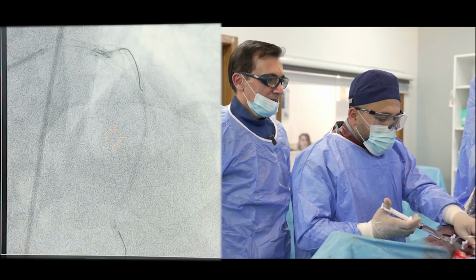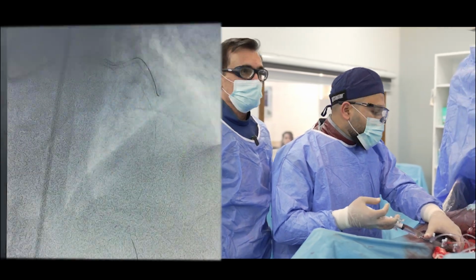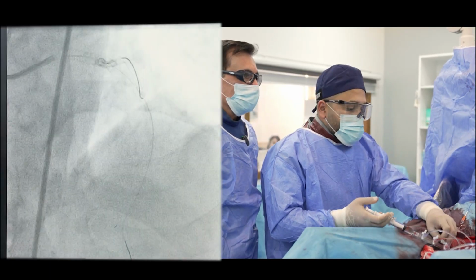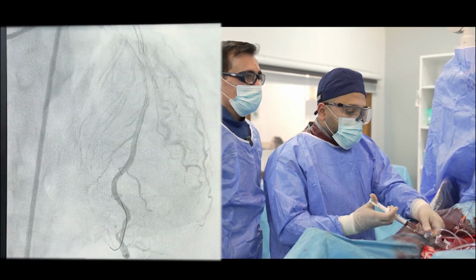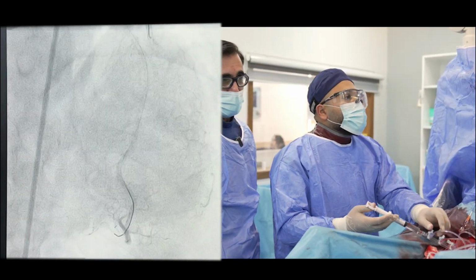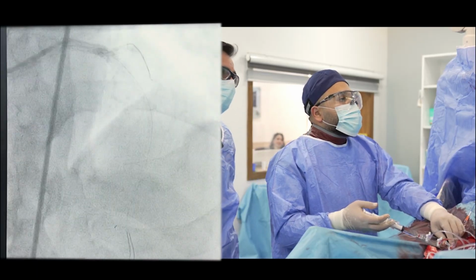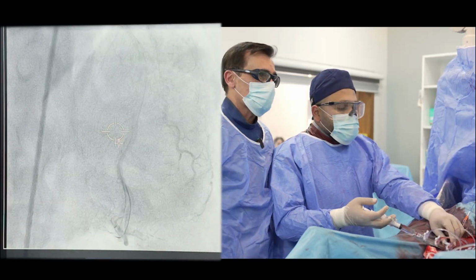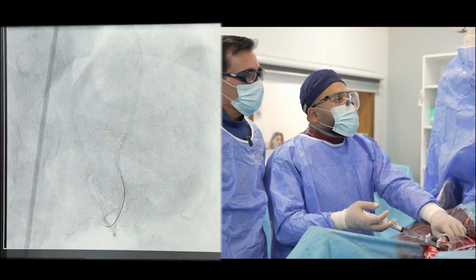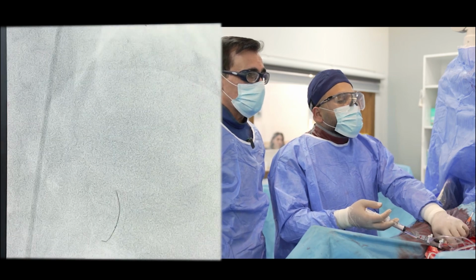Stop. So we are going to do the final angiography. Okay, angio. Yeah, that's good. Yeah, the LAD looks critical, but we have to depend on the FFR. And whatever is done, we can stent later on at any other time if the patient is still going to be symptomatic. But physiologically speaking, depending on the FFR, it is not significant.